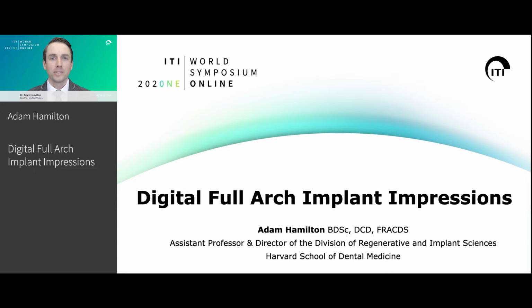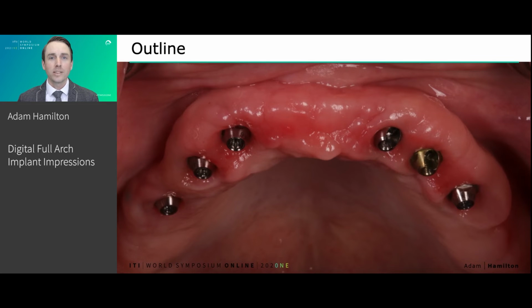My name is Adam Hamilton, and today we're going to do a deep dive into the world of digital workflows for edentulous patients, which begins with what is the cornerstone of edentulous rehabilitation, the impression. Now, I'd like for you to picture this patient here who presents to you with 6 well osseointegrated dental implants. And let's think about the options, about how can we start to rehabilitate this patient.